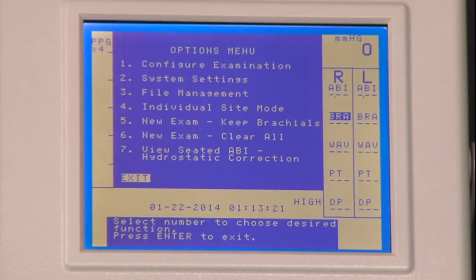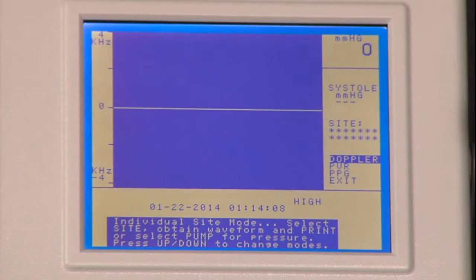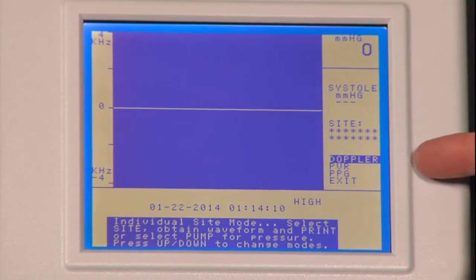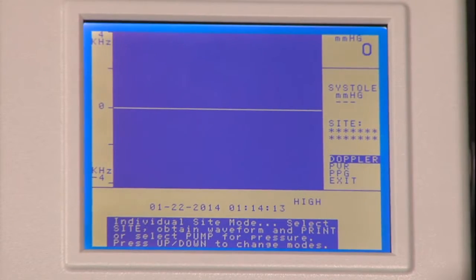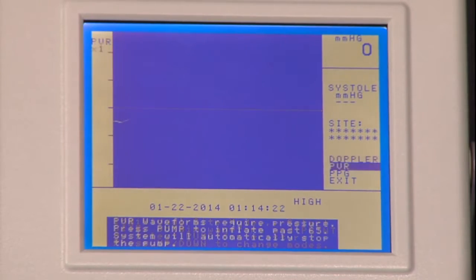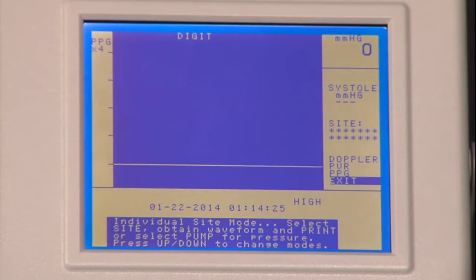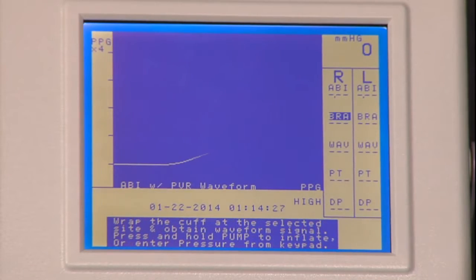Next we have number four, individual site mode. You would choose this option when you are not doing a full ABI exam and would like to just get a pressure at one specific site. Using your up and down arrows, you would choose your modality, and then pressing your site key to choose which body part. Going down to exit and pressing the enter menu key to exit.